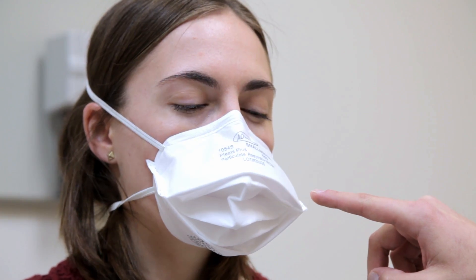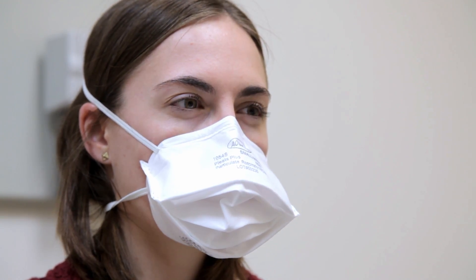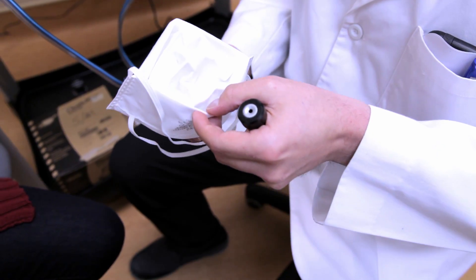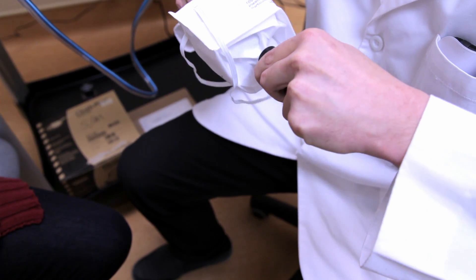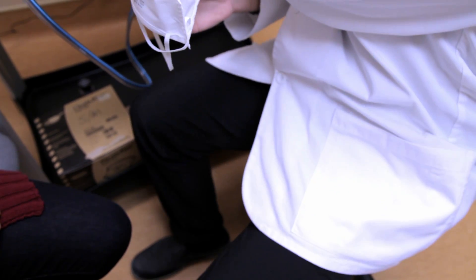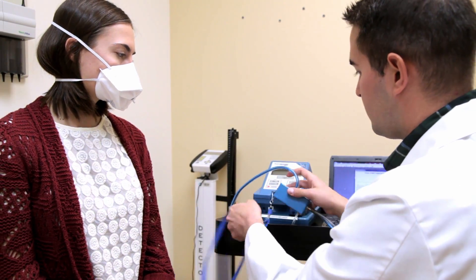Quantitative mask fit testing is the only method that should be considered when trying to ensure that mask integrity is being properly maintained. Our technicians perform quantitative mask fit testing which meets the Canadian Standards Association and the Occupational Safety and Health Administration guidelines for testing.